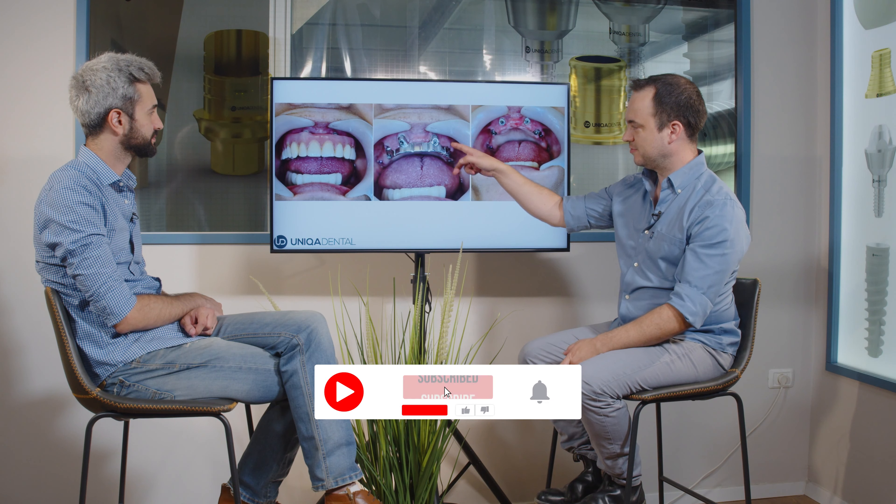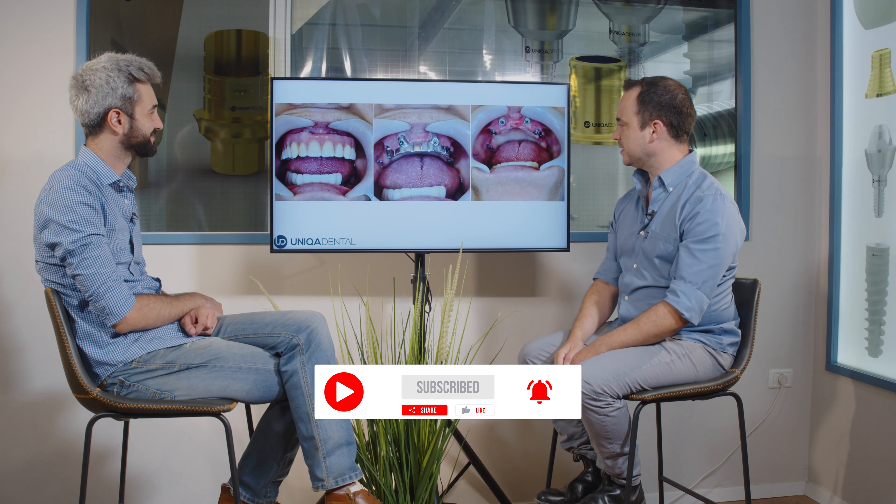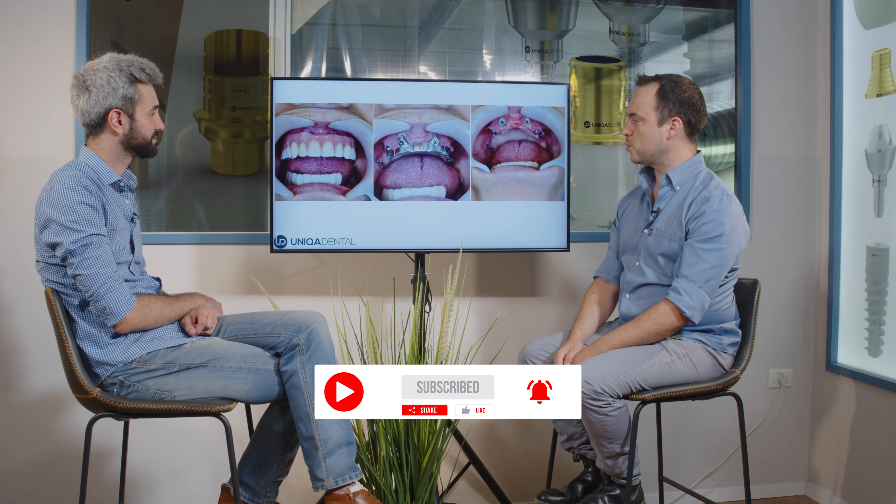We have a bar. We have an old denture on the bar. You can see that the original denture was made on five implants. We've added one more that you can see here in the posterior region. And we want to change the restoration from a removable denture on a bar to a non-removable prosthesis — a bridge.